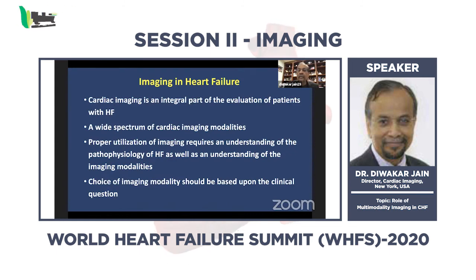The question can be to confirm the diagnosis of heart failure. A regular simple echocardiography can readily do that, or whether this patient would benefit from revascularization, or whether this patient has a rare condition like amyloidosis or sarcoidosis, then you would choose a technique based upon the question. So it's important that we pay attention to all these aspects of utilization of imaging modalities in patients with heart failure.